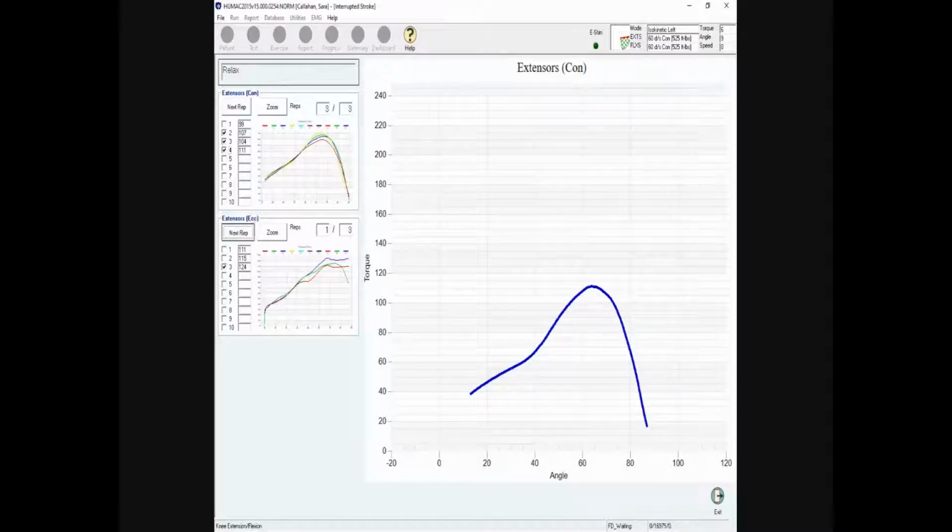And again, you're seeing that phenomenon here that as she's loading her quadricep rep after rep at 100%, that inhibition that she has from the injury is reducing, so she's getting higher torque amounts with better curves.